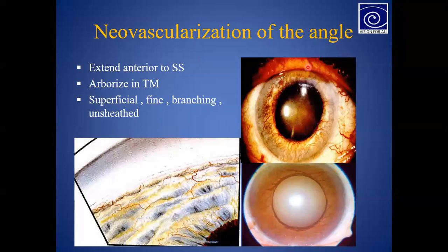So, neovascularization of the angle. If you are getting neovascularization in the iris, then in those types of conditions you will also be required to perform gonioscopy. So how will it look in the angle? This neovascularization will look like this. Here you can see this neovascularization continues into the angle also. Okay, so अगर angle में भी आ रहा है, that means that is abnormal.